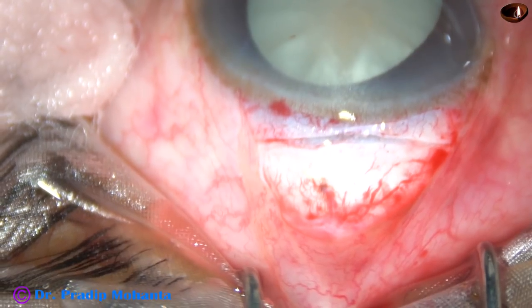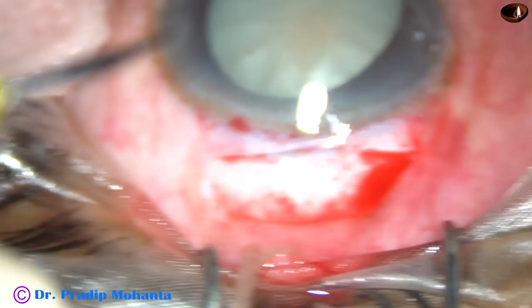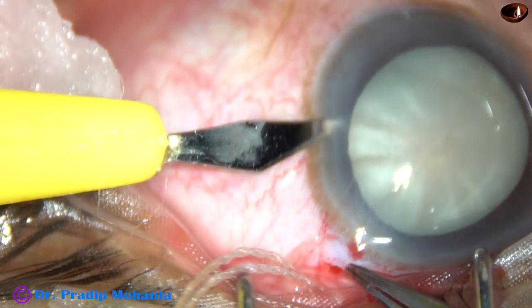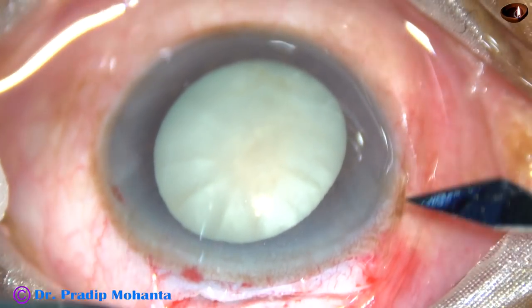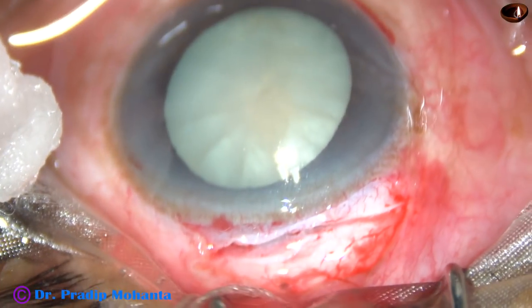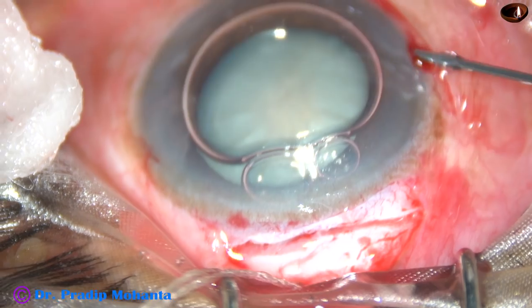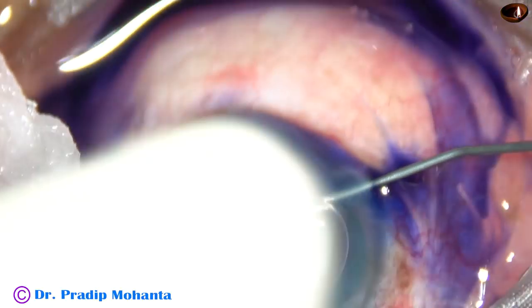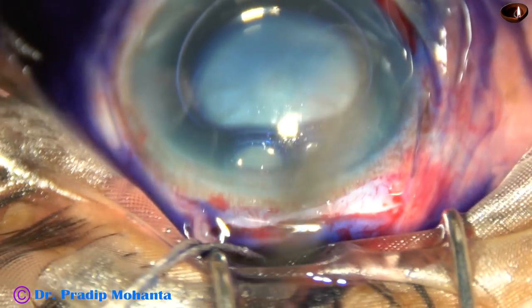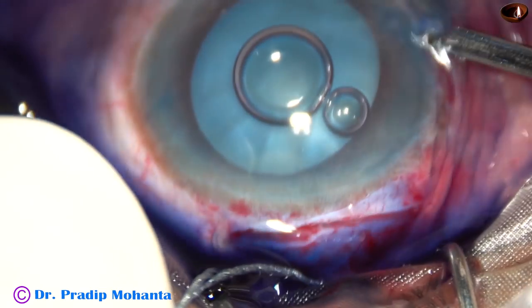You can see this is an intumescent cataract. My plan is to put the intraocular lens under irrigation, and that is why I have put two side port incisions. In intumescent cataracts there is a high chance of the rhexis going to the periphery. So what I do in such cases is first perform a very small rhexis — I call it a mini rhexis.